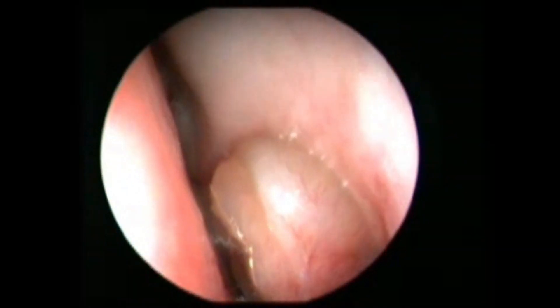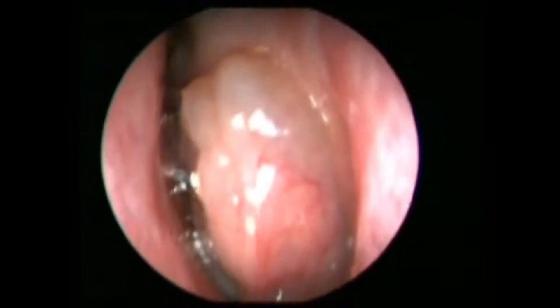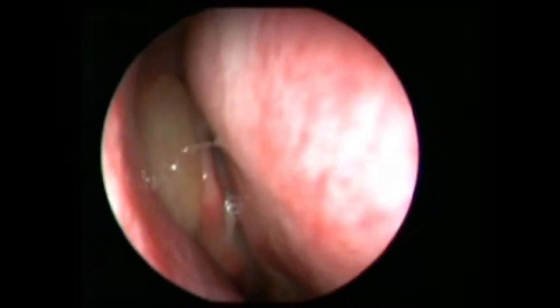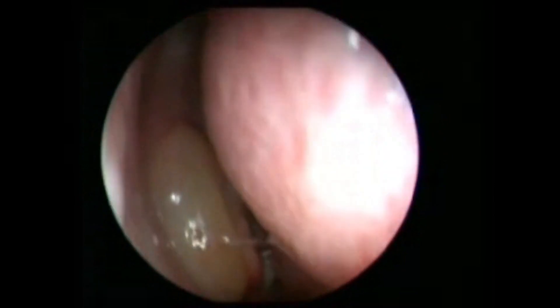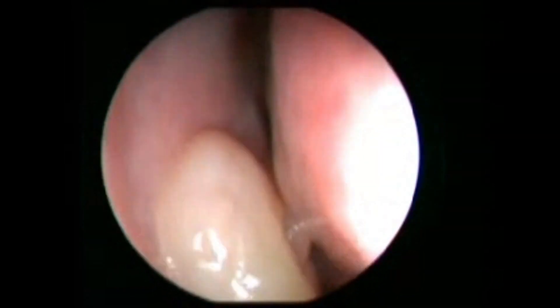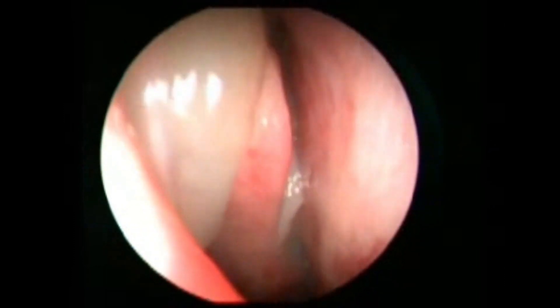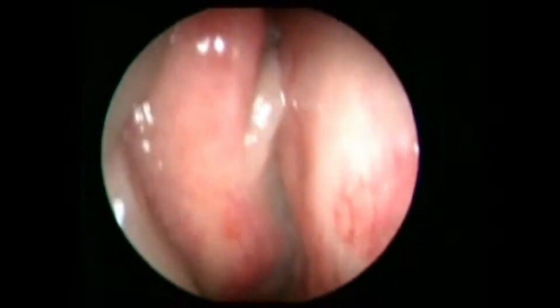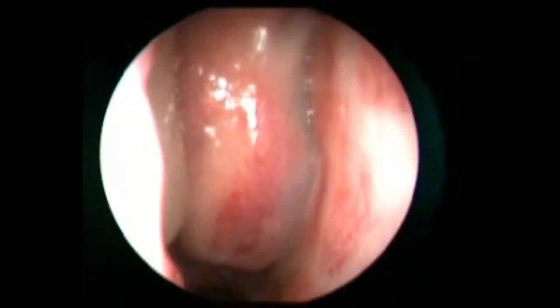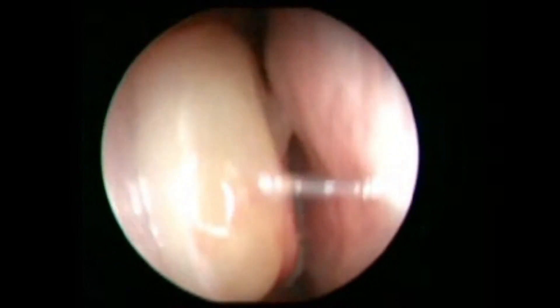The middle turbinate is almost completely hidden. Similarly on the right side, there is a polyp in the middle meatus and a polyp medial to the middle turbinate also. So it is arising from both the anterior and the posterior ethmoids — the posterior ethmoid ones are seen medial to the middle turbinate.